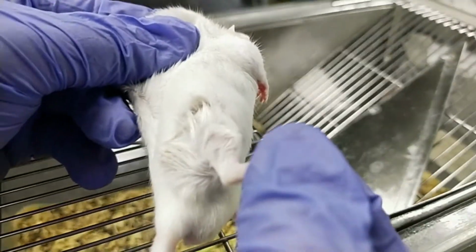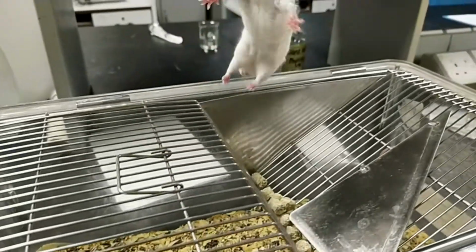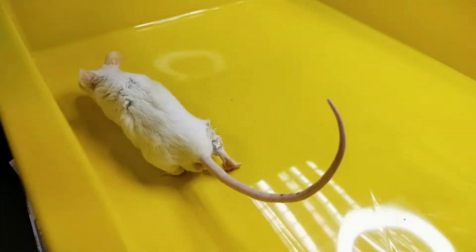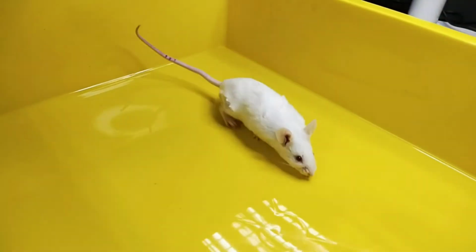Then after that, we're going to transfer the mice to the tray, and we're going to monitor the mice for a few minutes to see whether we have any kind of reflex happen after a few minutes.